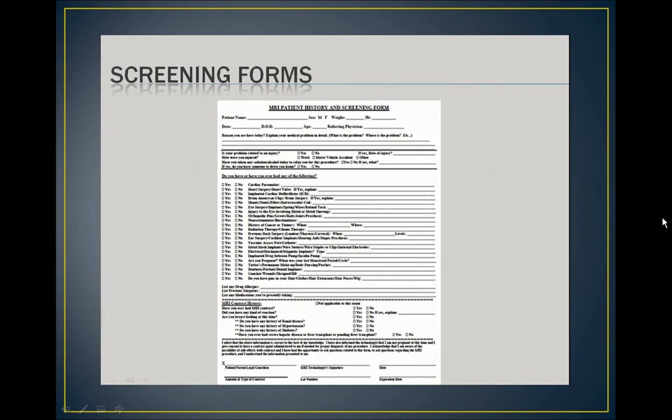It is also important to screen for any allergies if the patient is getting a contrast injection. Do you have seasonal allergies, allergies to MRI contrast or any other type of contrast, asthma, or respiratory disease? Have you ever been diagnosed with diabetes, renal disease, or high blood pressure? Do you have any liver disease or sickle cell disease? Have you ever had a liver transplant or renal transplant? Also, we need to screen for pregnancy, tattoos, permanent eye makeup, body piercings, and drug patches.